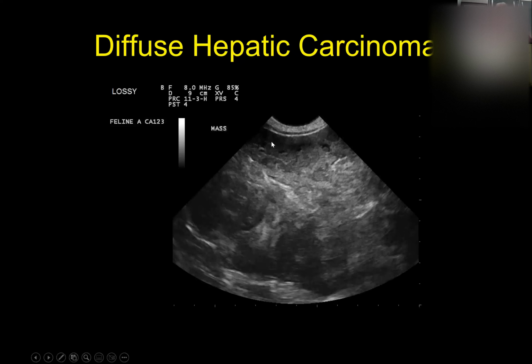Okay. What about this liver here? And your first thought should be, what liver? Well, this whole thing was the liver at one point in time. But this liver has numerous large, irregularly shaped, heterogeneous, solid appearing mass lesions all in the liver. And it's also got multiple variously sized cavitary heterogeneous mass lesions elsewhere inside the liver. I don't see heart, maybe right in here, maybe a little bit of kind of normal looking liver, but not much of it in the way of any normal appearing liver.